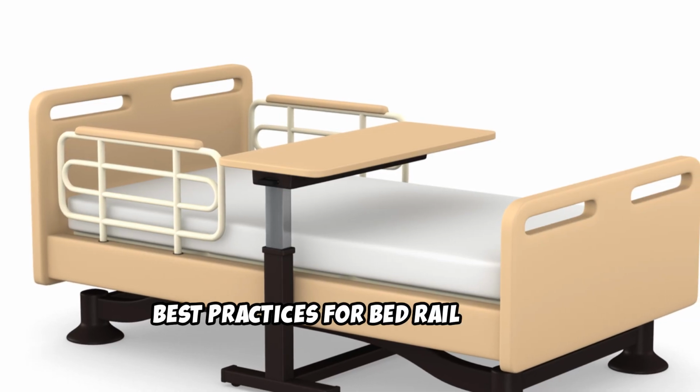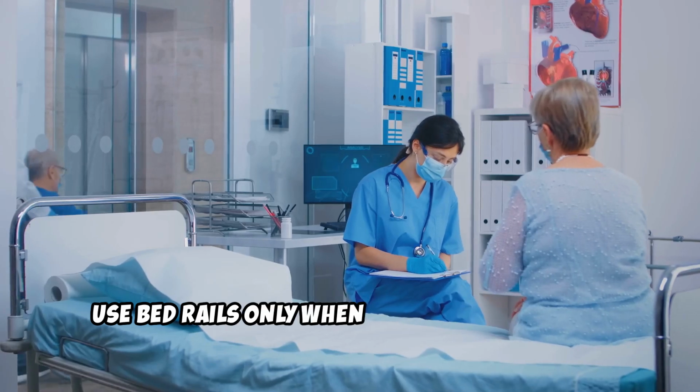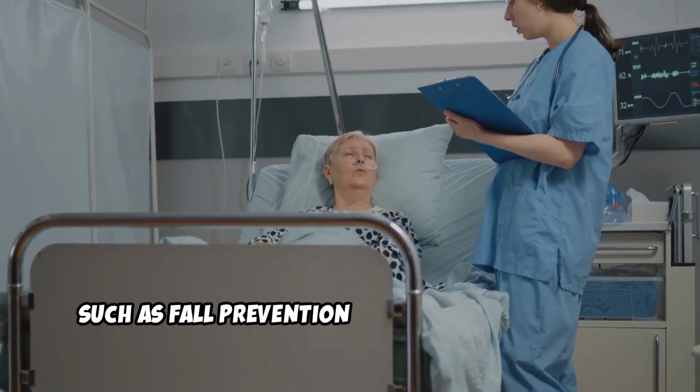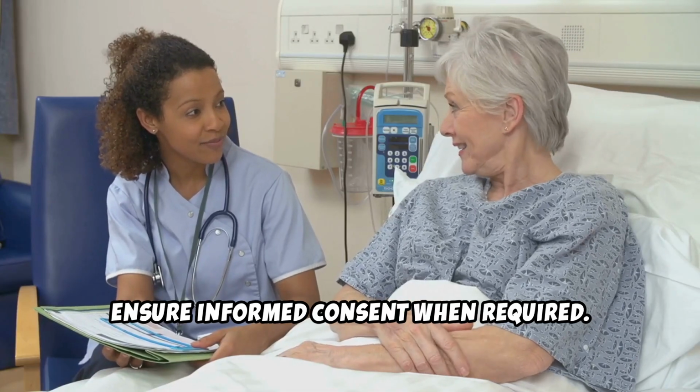Best practices for bed rail use are essential for patient safety. First, use bed rails only when clinically necessary. Make sure to document the reason for use, such as fall prevention or mobility assistance. And of course, ensure informed consent when required.